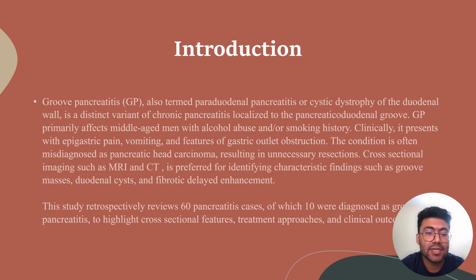Cross-sectional imaging such as MRI and CT is preferred for identifying characteristic features such as groove masses, duodenal cysts, and fibrotic delayed enhancement. This study retrospectively reviews 60 pancreatitis cases, of which 10 were diagnosed as groove pancreatitis, and aims to highlight cross-sectional features, treatment approaches, and clinical outcomes.